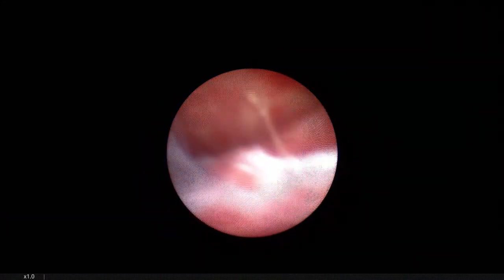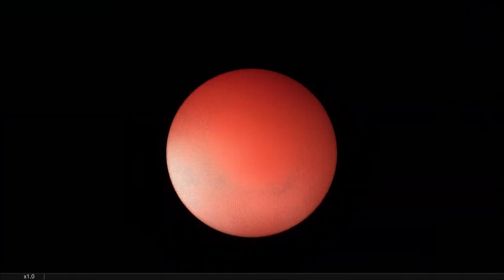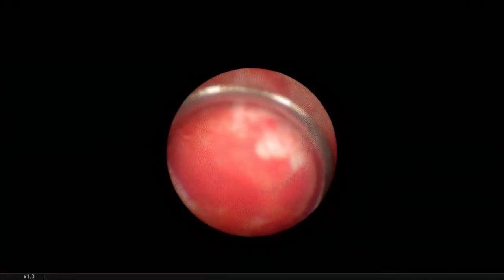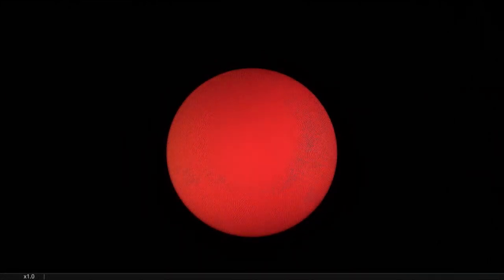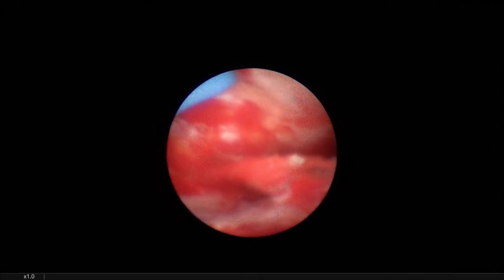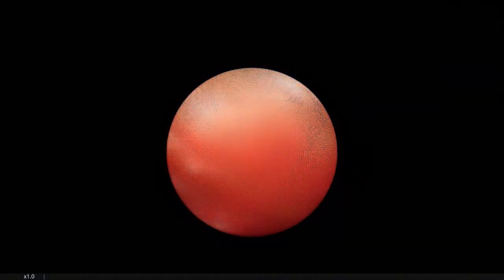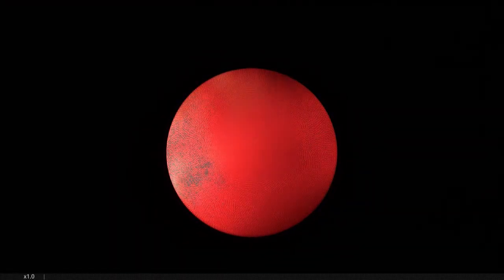Kommt noch nicht. Rausgeführt. Okay. Balloon catheter. The balloon is no longer inflated? No, the balloon catheter is empty. Yes, that's what we see. But this doesn't matter. This is the way to our upper calyx. This is the upper calyx, yes.